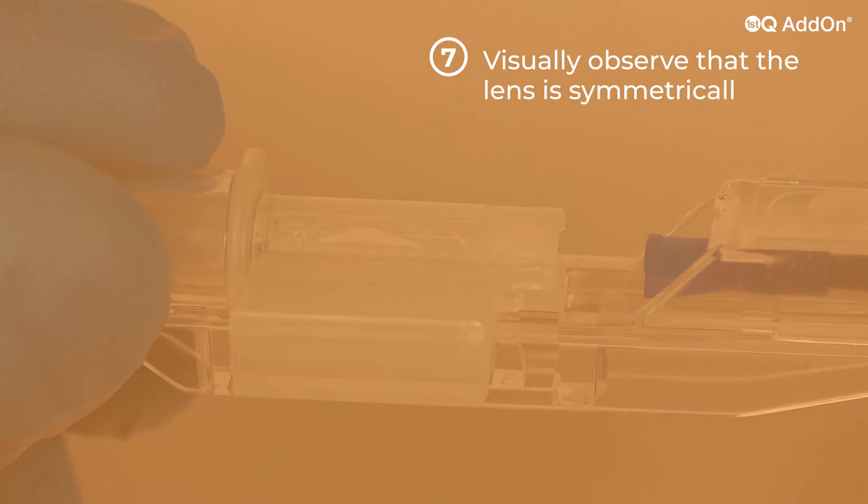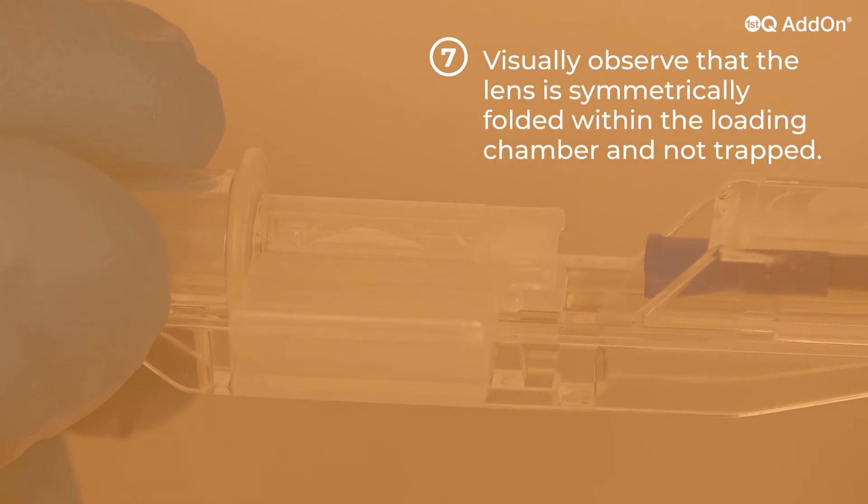Before starting the injection, visually observe that the lens is symmetrically folded within the loading chamber and is not trapped.